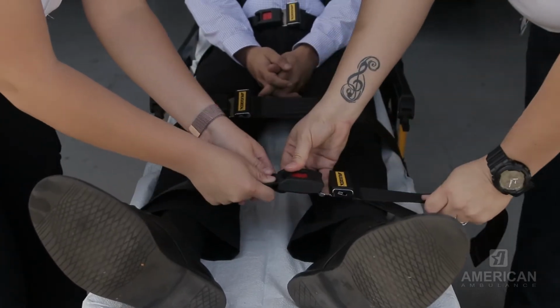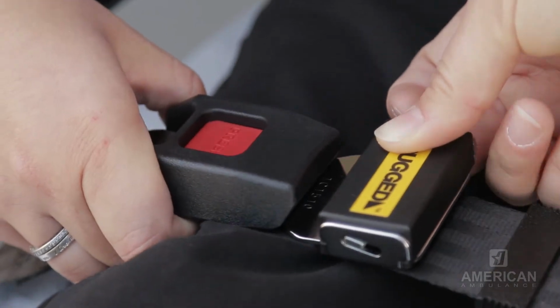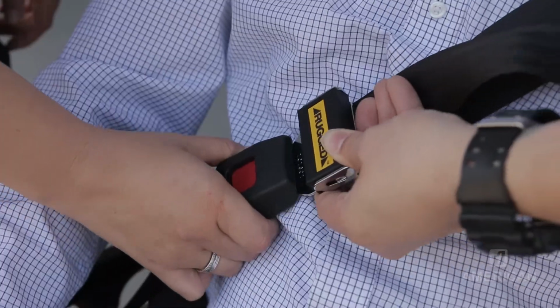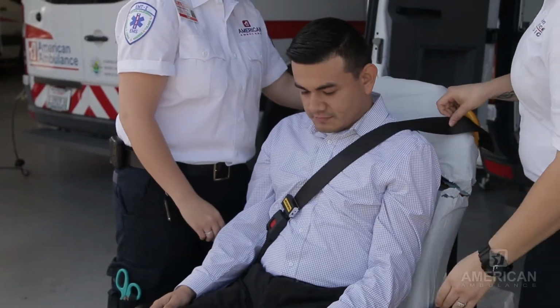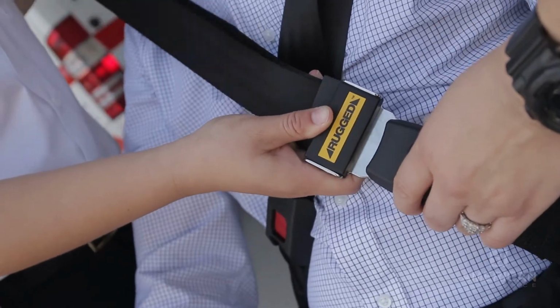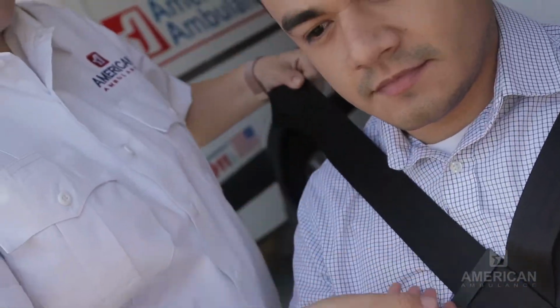This also has different safety restraints. It has 5 safety restraints. It's got an ankle strap, a thigh strap, a waist strap, and 2 crisscrossing shoulder straps. All 5 of the safety restraints need to be applied to the patient before you move them into the back of the ambulance. Again, remember to use all 5 safety restraints.